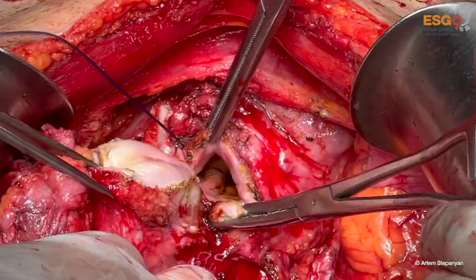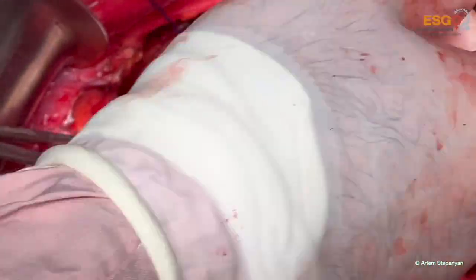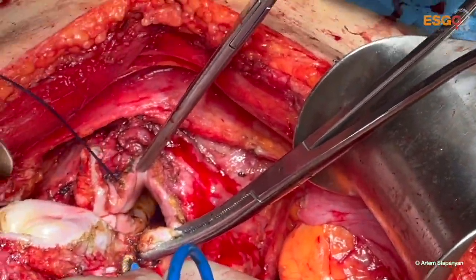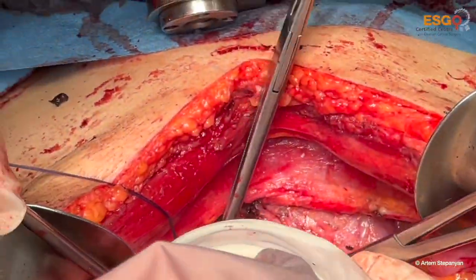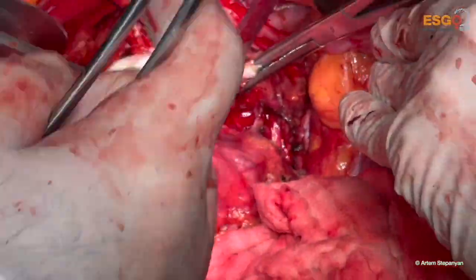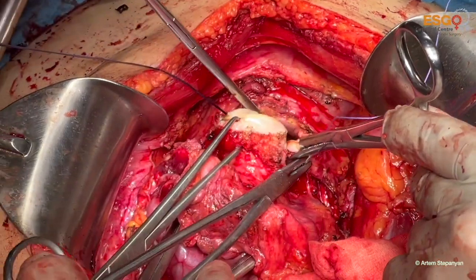The same on the right side. We have the vaginal and the distal uterine vessels in this clamp. And we see the uterine cervix in the bullet forceps.